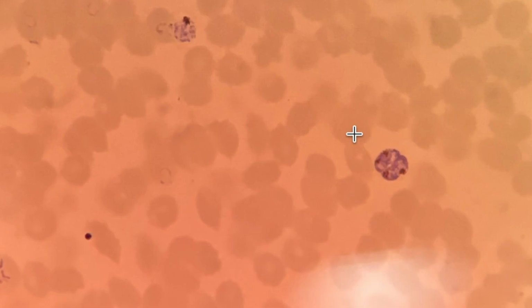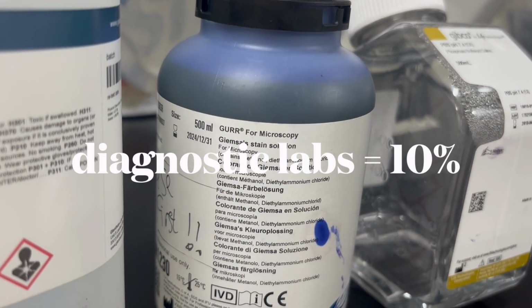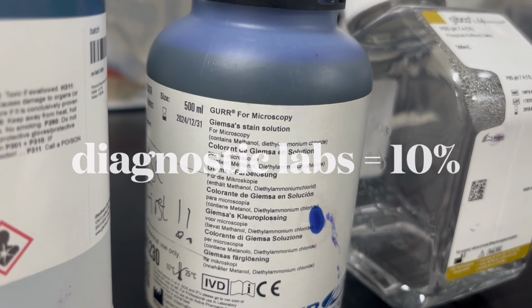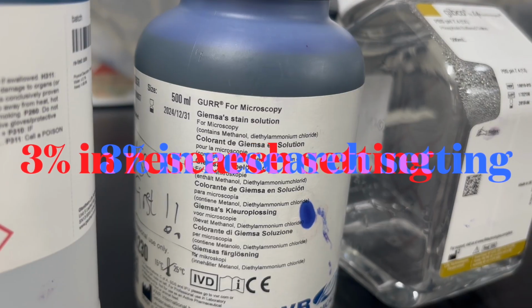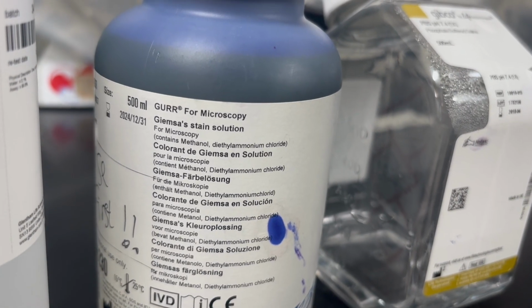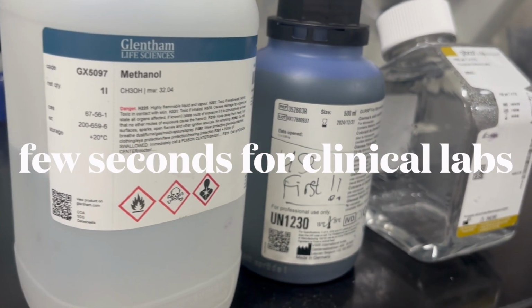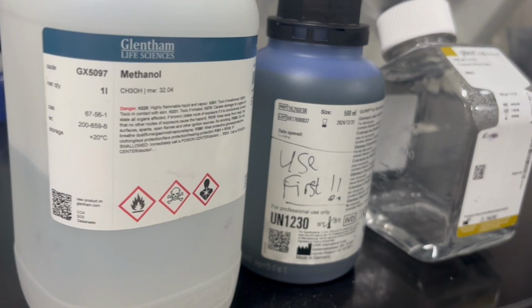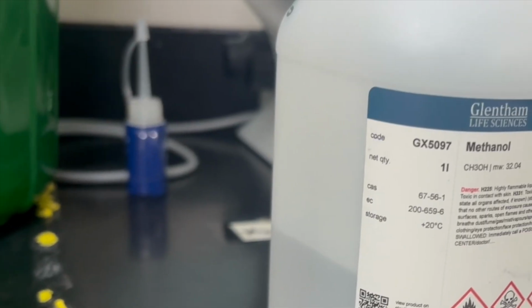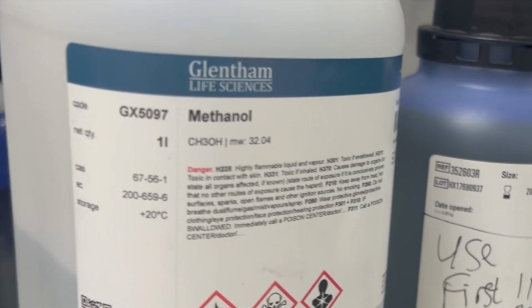So for diagnostic labs, they go for a 10% solution of this Giemsa stain. For the research laboratory, it's recommended that you use a 3% stain. And what you do is fix your slide with methanol. For rapid diagnosis in the laboratory, they usually do it for only a few seconds, but in the research setting, it's recommended you do it for like 30 seconds. I've seen protocols where they're routinely doing the fixation in methanol for even up to 3 minutes.